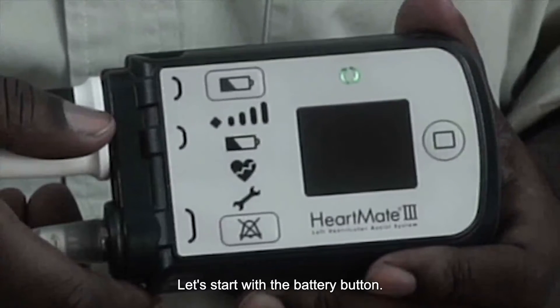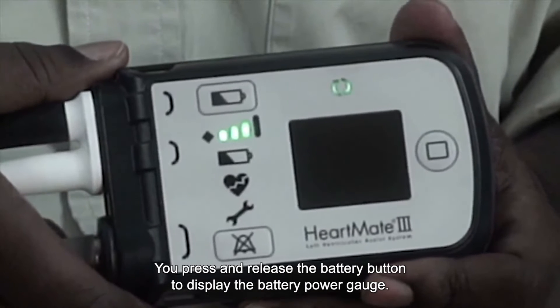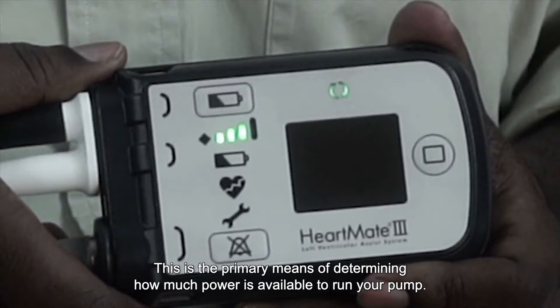Let's start with the battery button. You press and release the battery button to display the battery power gauge. This is the primary means of determining how much power is available to run your pump.